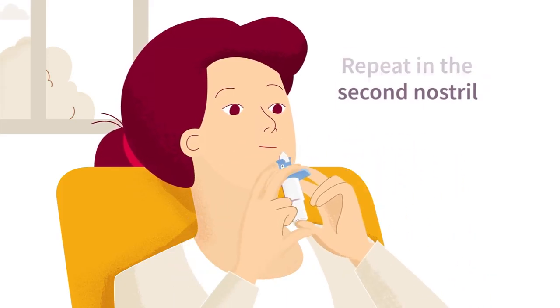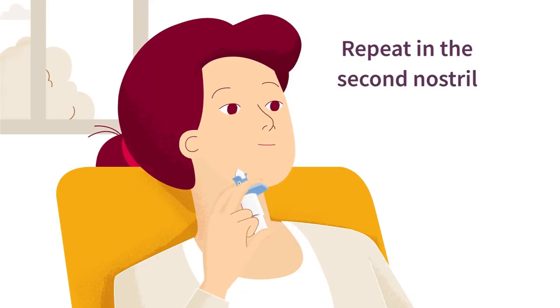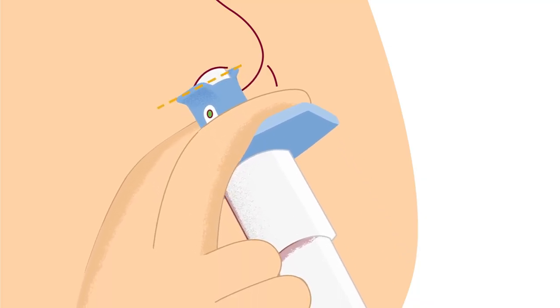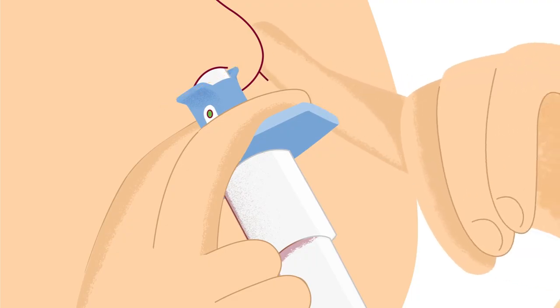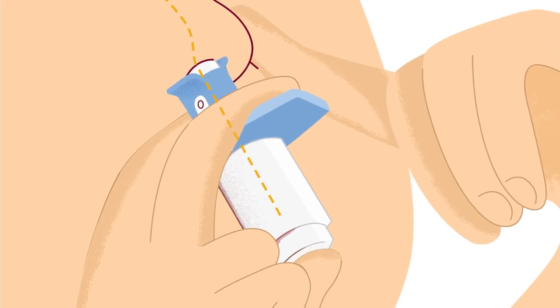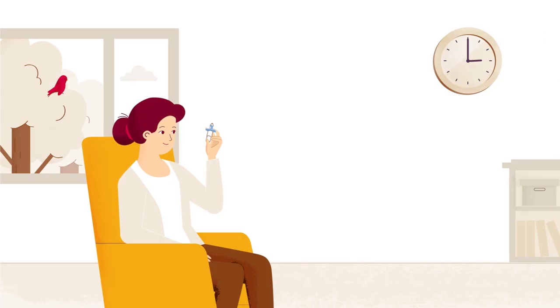Now, repeat the same steps to administer Spravato into your second nostril. Keep your head tilted back at a 45-degree angle. Switch hands and insert the top of the nasal spray into your second nostril, making sure the nose rest is touching the skin between the nostrils. Use your finger to close the opposite nostril. Then breathe in through your nose while pushing the plunger all the way up until it stops. Sniff gently to keep the medication inside your nose.